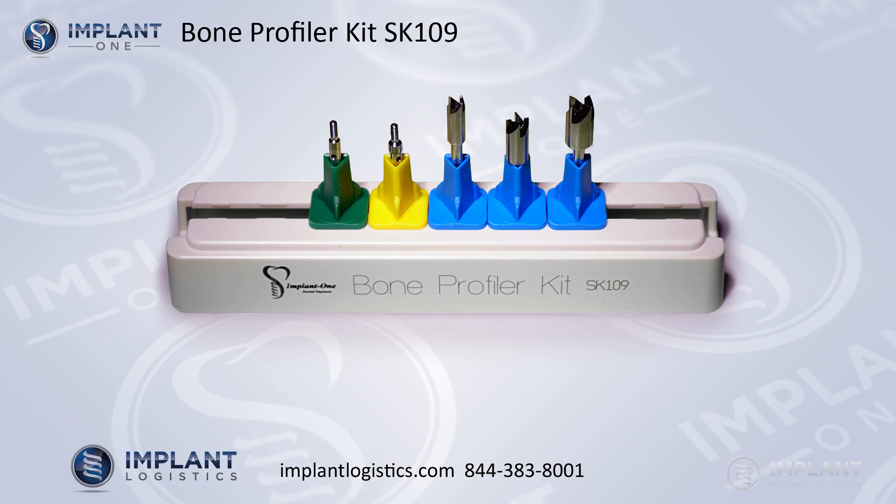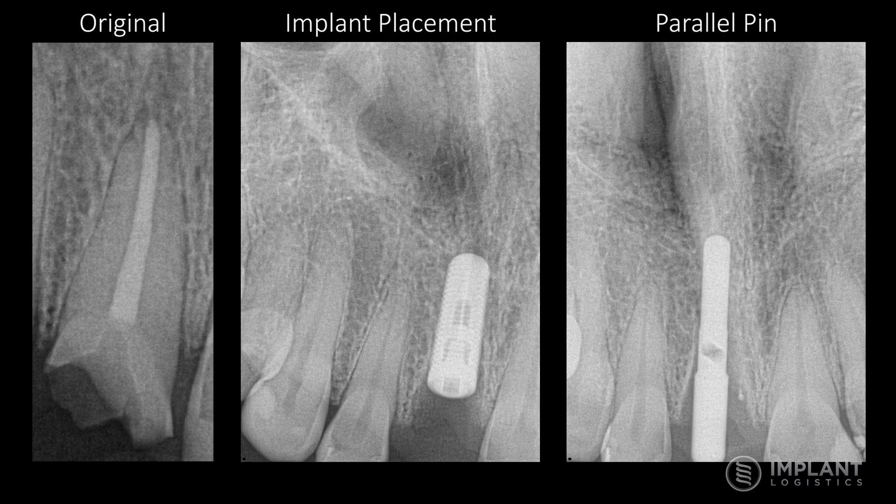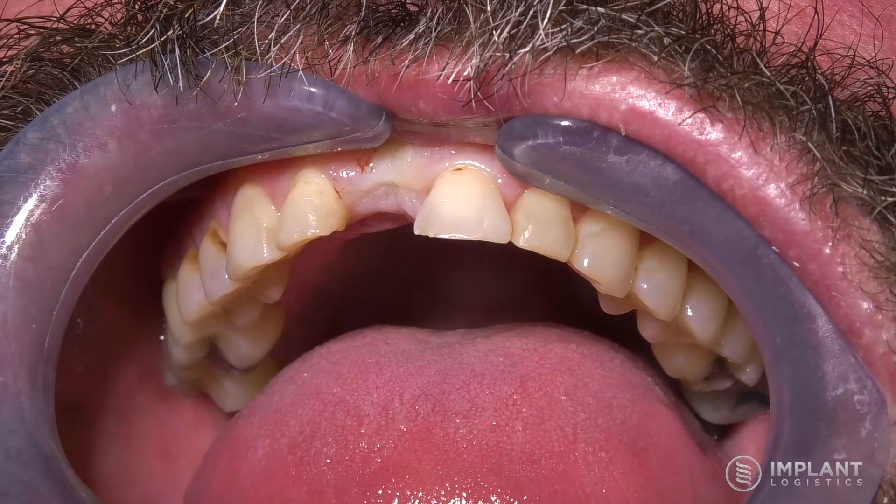This short video is designed to go over the Implant One bone profiler kit for the Implant One system. What you're looking at here is the original x-ray of the tooth in place, followed by the implant placement and the parallel pin that was used just prior to placing the implant. The system was designed to be placed subcrestal.